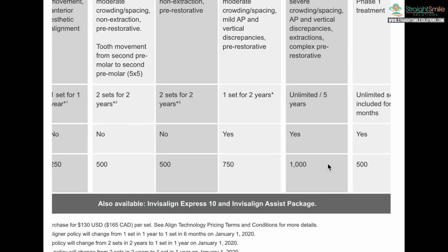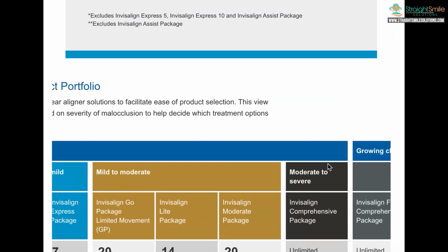Again. And then, lastly, I think what is really cool though about Invisalign, they do have their digital class now. That was a huge deal. I think that they released it. I heard there's like zero substance to it for those people who've taken it. So make sure if you don't understand, personally, I think anyone who's doing aligners should also understand braces and brackets because you really can't understand how teeth move unless you've done some cases. So you should be doing all this at one time.